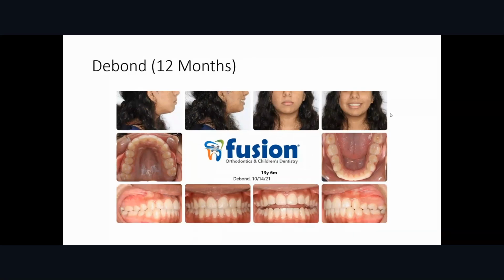One thing I want to bring your attention to is the upper occlusal photo. Notice that we were able to close that premolar space while we maintained the arch symmetry. Normally, with poor man's orthodontics, whenever we do a unilateral extraction, the arch form is not symmetric on the extraction side. Usually it collapses a little bit. But here it shows to what degree we are able to maintain the arch form. It's as if we have replicated sliding mechanics, whereas in the Brius system, there is no sliding. We don't slide, we just move things by the arms.